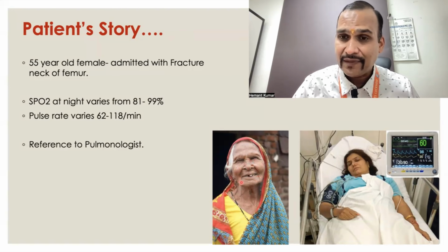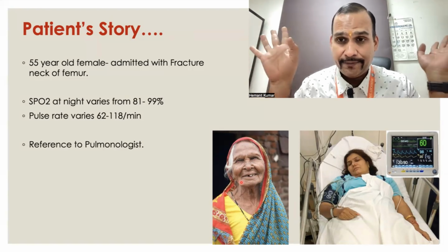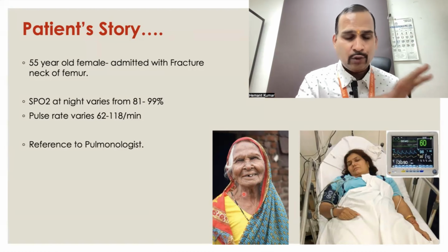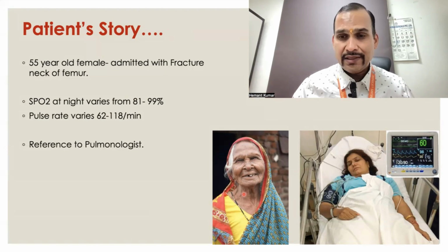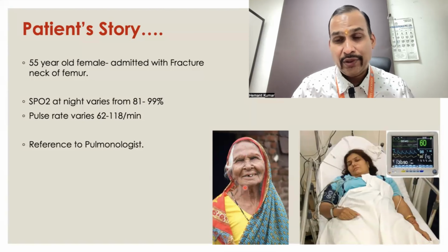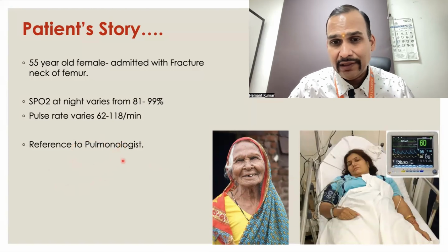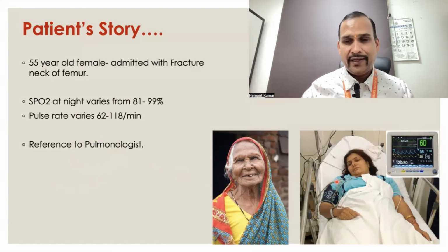was very caring. She was watching the monitor continuously the whole night, and whenever the patient was sleeping, her saturation was falling down. She went to the staff nurse to wake her and tell her that saturation is going down. So the whole night she didn't sleep, and the staff also didn't sleep. Very interesting, because at night saturation was falling. So another day we got reference from this patient that oxygen saturation falls at night while sleeping.